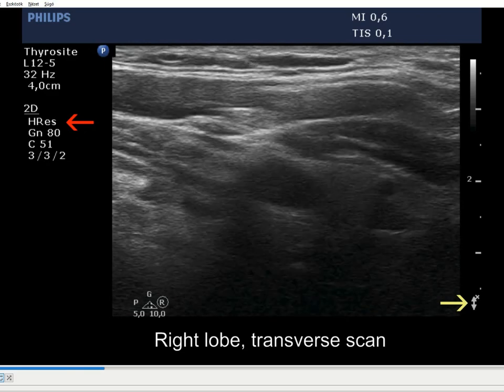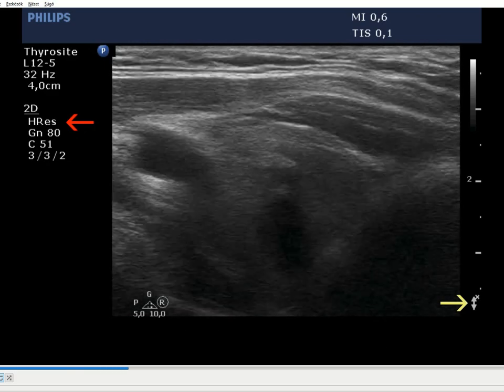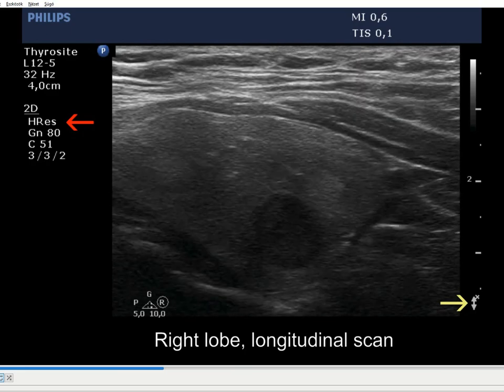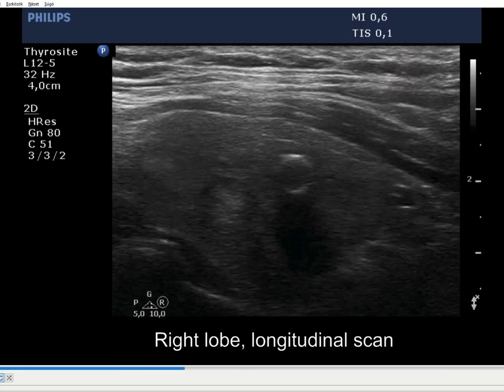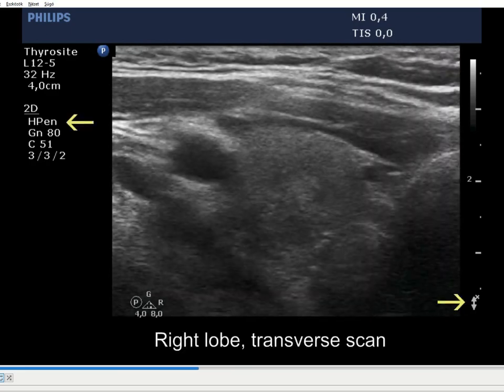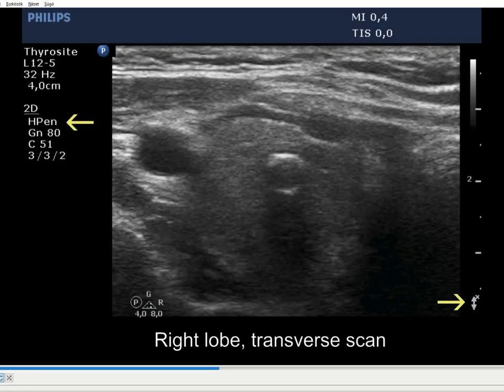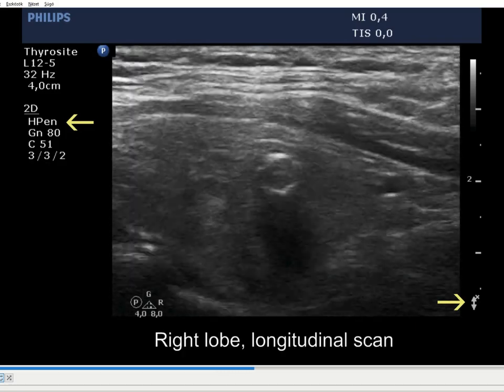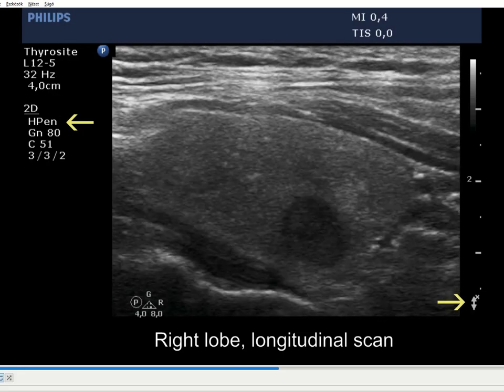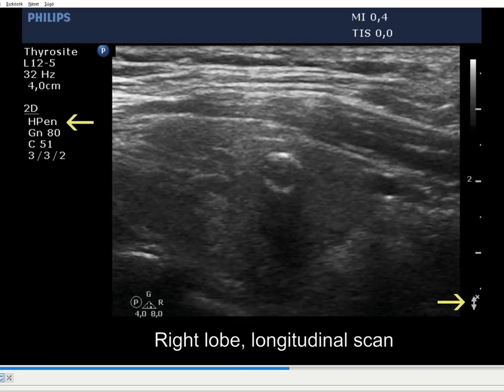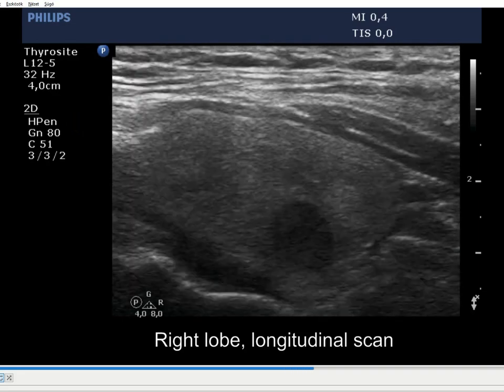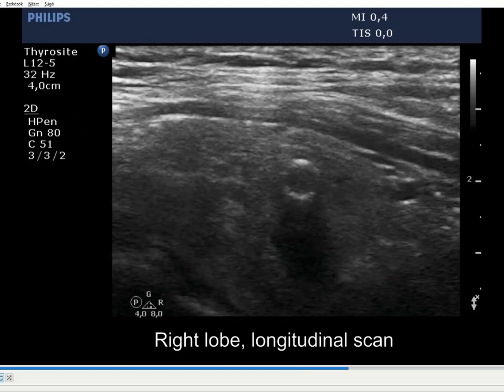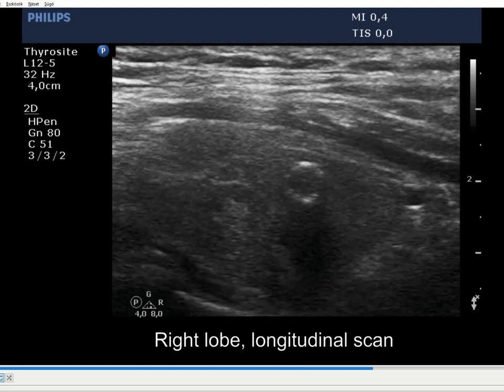Setting the focus more dorsally improved the quality of the dorsal parts, while the ventral areas remained almost unchanged. On the third occasion, we changed the setting from better resolution to better penetrance. While the sharpness of the image deteriorated, the dorsal parts thus became truly perceptible.